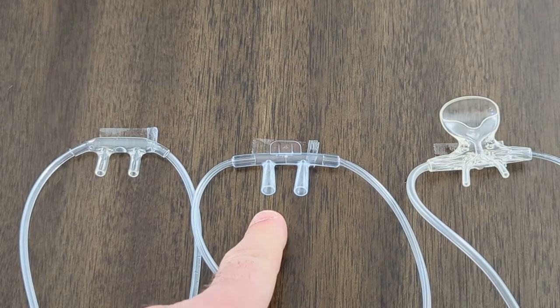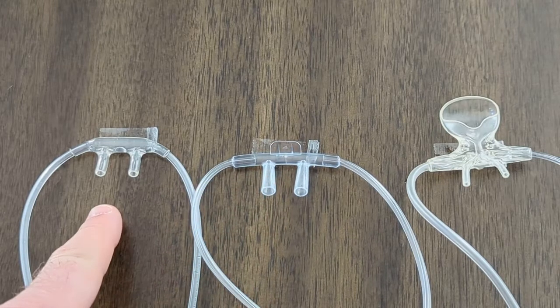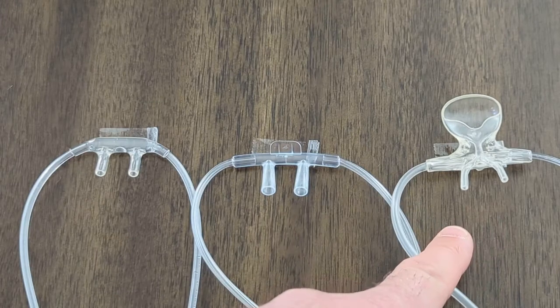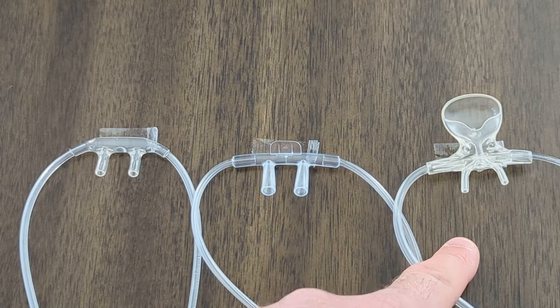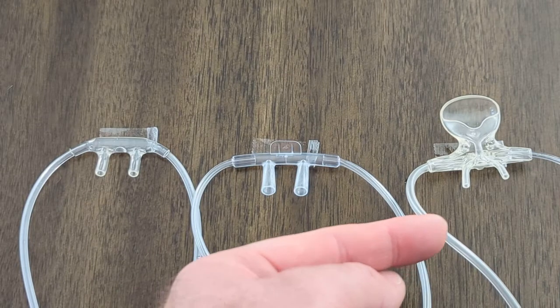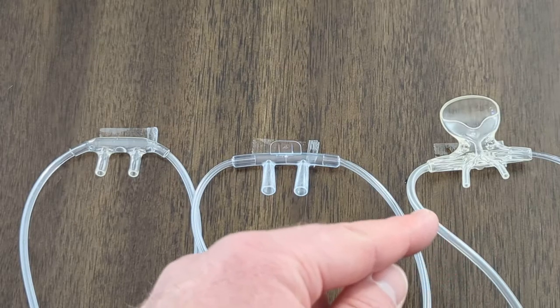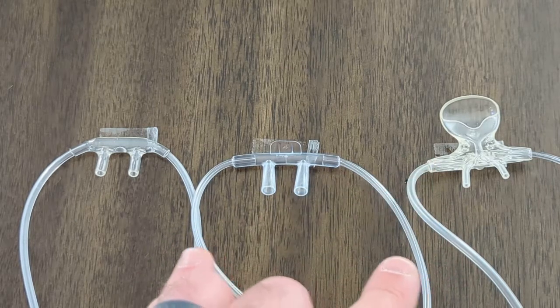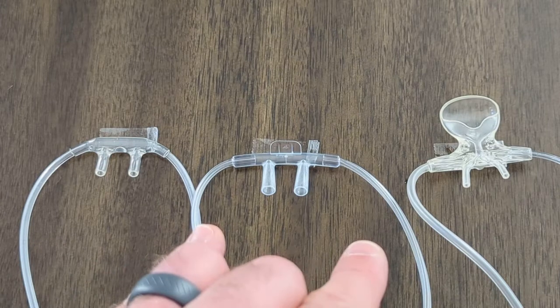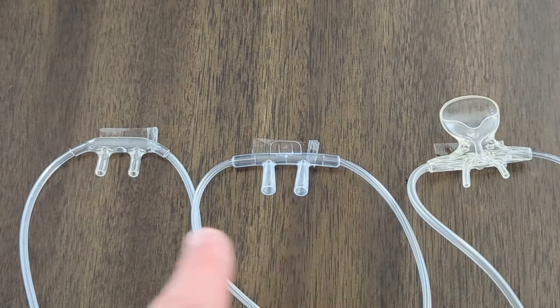Although the diameter looks larger on the center cannula, at the base it is the same as the cannula on the left. On the right is our normal end-tidal nasal cannula. I want to point out that only the left line is the inlet for oxygen. On the right is the CO2 sampling. So only this is allowing oxygen to pass instead of the other two, which have two lines allowing oxygen to pass in. Lastly, look at the diameter of the opening on these oxygen outlets. It's much smaller than it is on these two.